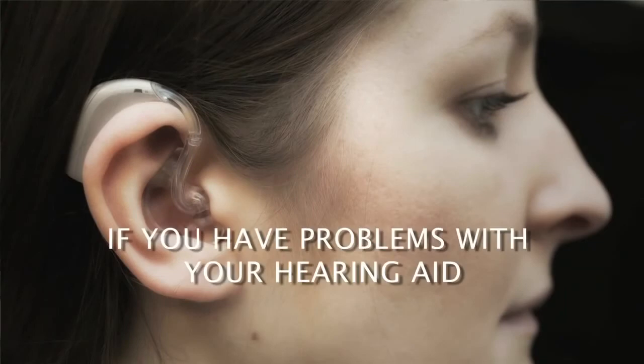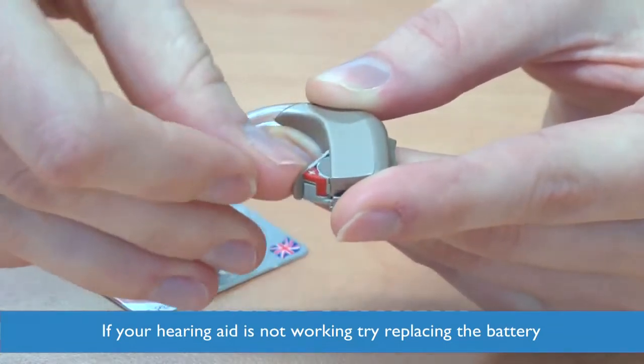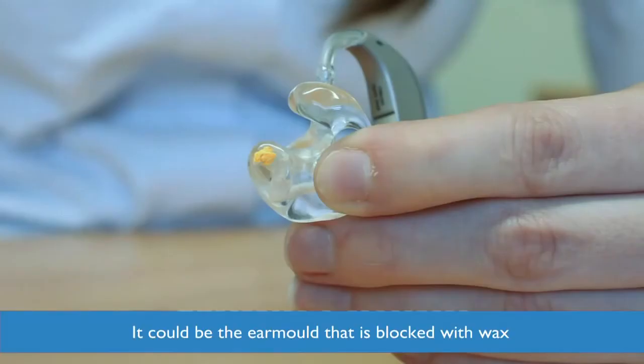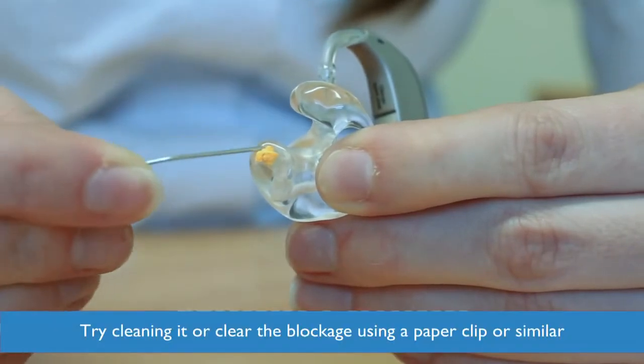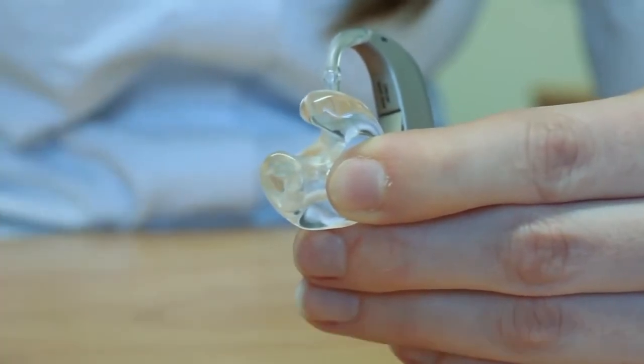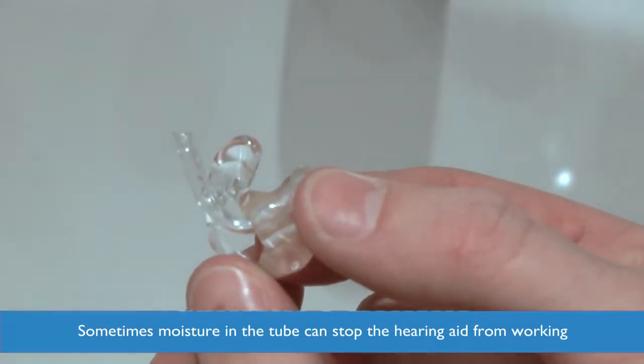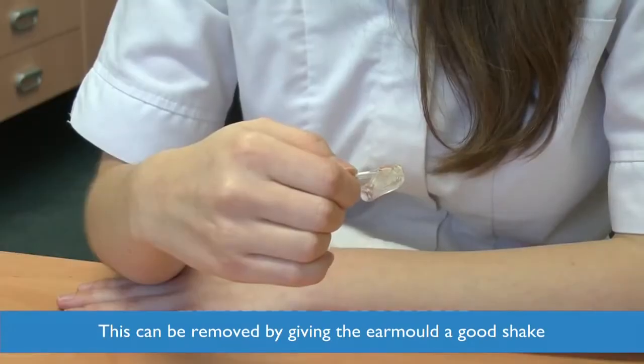If you have problems with your hearing aid. If your hearing aid is not working, then one of the first things to try is a fresh battery. It could be the ear mold is blocked with wax, so try cleaning it, or clear the blockage using a paper clip or similar. Sometimes moisture in the tube can also stop the hearing aid from working. This can be removed by giving the ear mold a good shake.